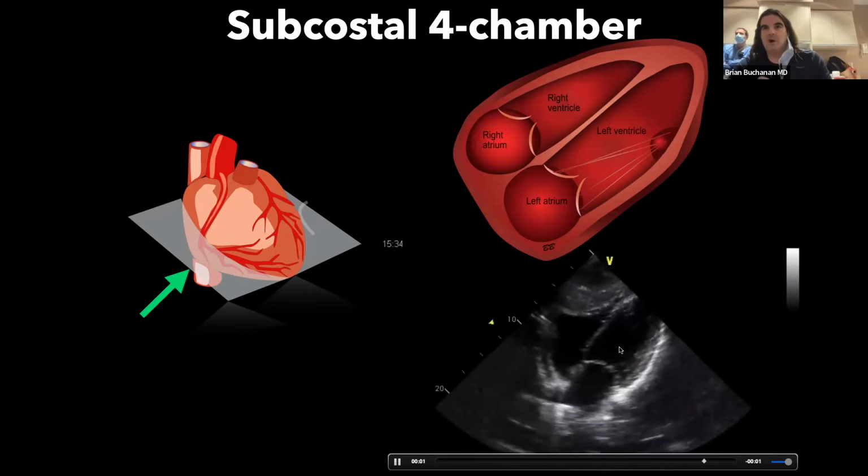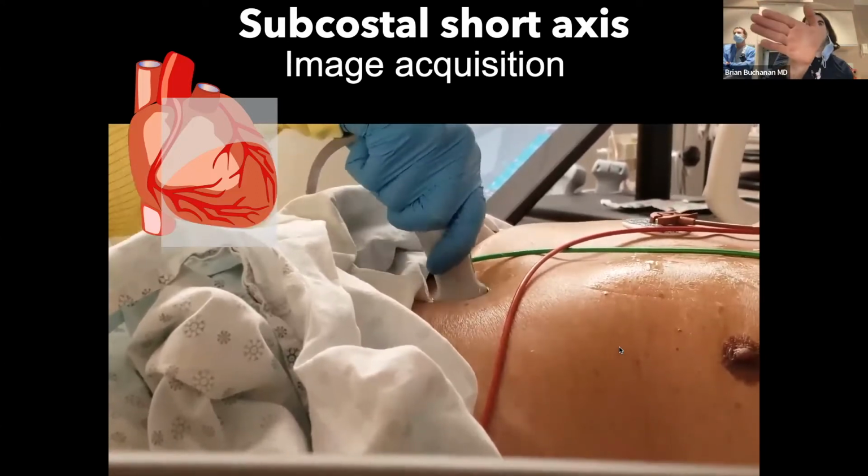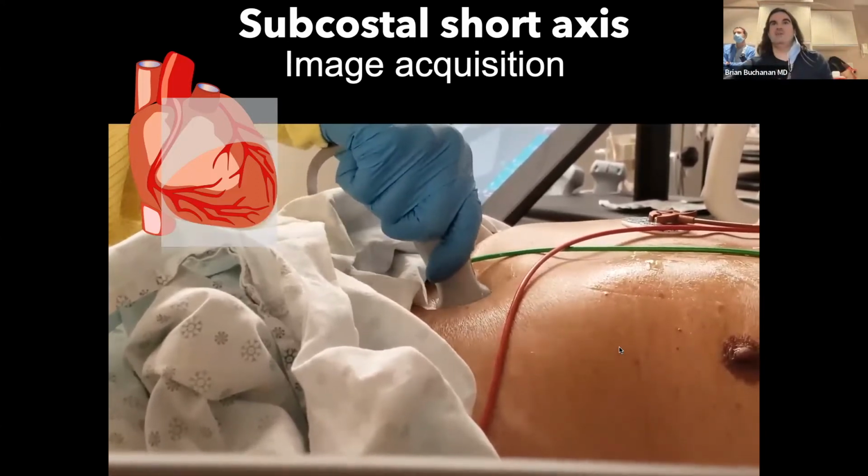Especially if you know how to acquire, let's say, a subcostal four-chamber and a subcostal short axis. So that's the next thing here. Almost like an IVC where the probe marker is facing up, rather than focusing on the IVC, the probe moves towards the patient's left side, which allows you to have a cross section of the LV. If you draw a line up from this view, you'll notice it's the same orientation as a parasternal short axis, but it's from under the sternum or under the rib cage.